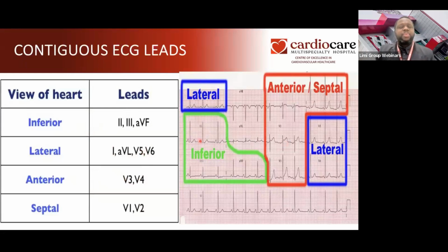If you have that ST depression or ST elevation in any of these leads, especially in 2 or more of these similar leads, you can see how we have grouped them as similar leads, then it means that the ST depression or elevation is very significant, and that chest pain is very likely due to a coronary artery obstruction. This is very important for us to know. I'm sure that we can take this very well.